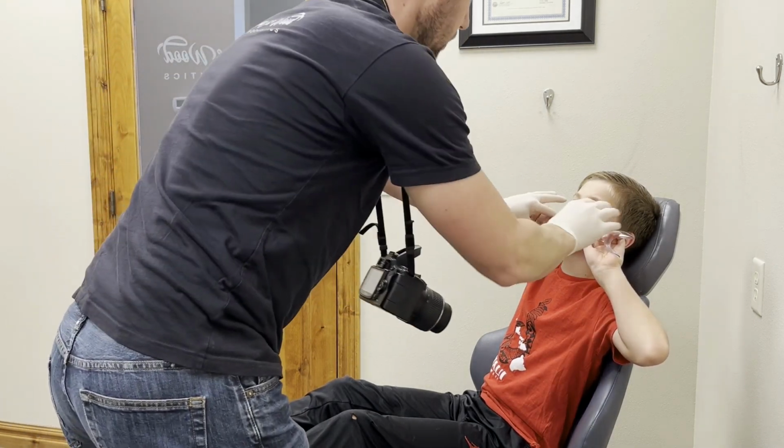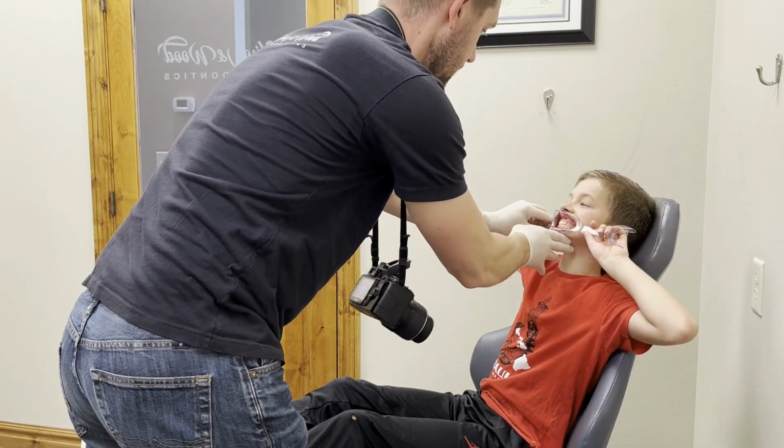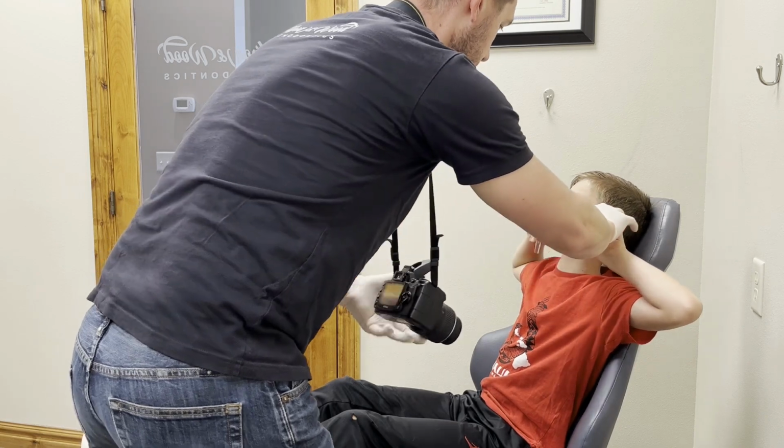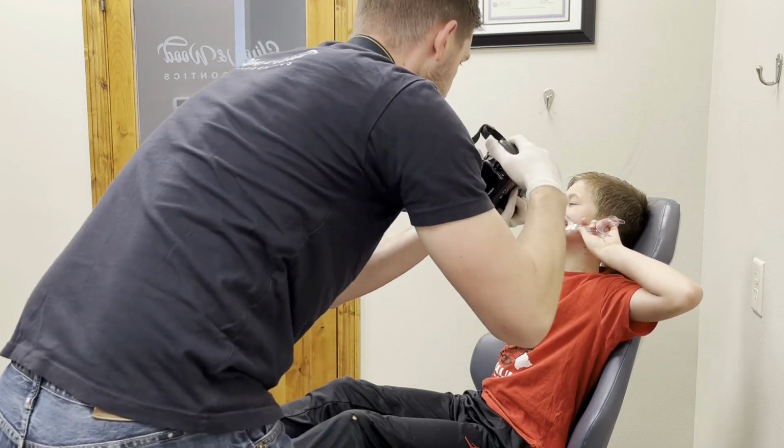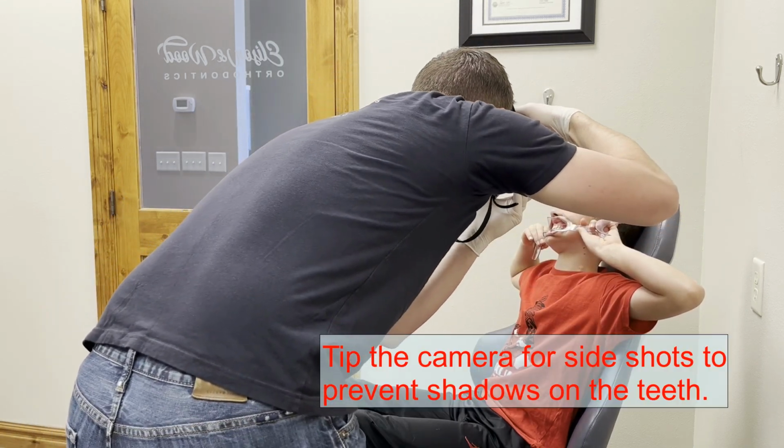Perfect. And then relax this one and pull back on this one. Kind of turn your head to your right here. Turn your head way over. Pull back hard, hard, hard on this one. Really hard. Bite together on your back teeth. Just bite all the way together. Perfect. Stay just like that.